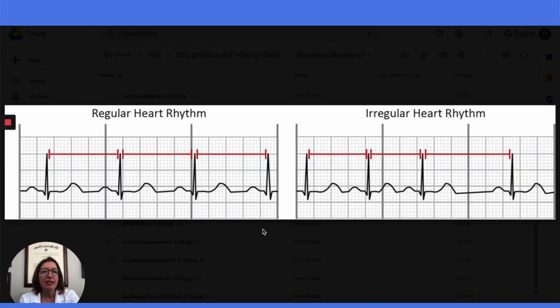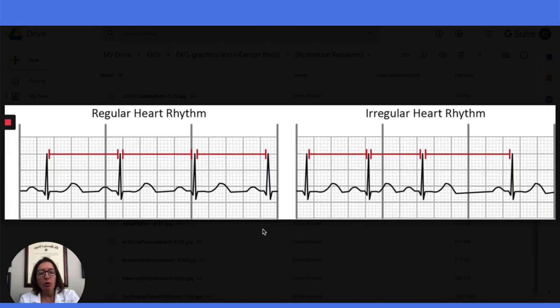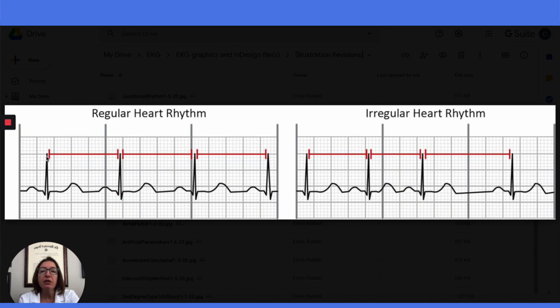Let's talk about how to analyze the heart rhythm. We want to check to see if the rhythm is regular or irregular, and we want to check both the atrial heart rhythm as well as the ventricular heart rhythm. This strip on the left shows how we would go about analyzing the ventricular heart rhythm. We would measure the distance with calipers between one R wave to the next, and you can see that it's the same distance between all R waves, so we have a regular ventricular rhythm here.